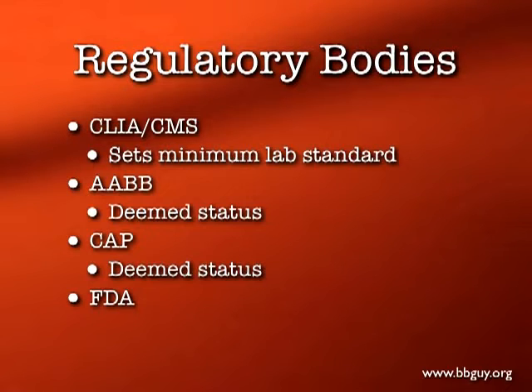The FDA, on the other hand, at the bottom, doesn't do a lot with pre-transfusion testing. There are some things that we'll talk about later in terms of the FDA mandating which antigens need to be represented on antibody screen cells. But aside from that, they're not nearly as involved in pre-transfusion testing as they are in the production of the red cells or the other components in the blood center.